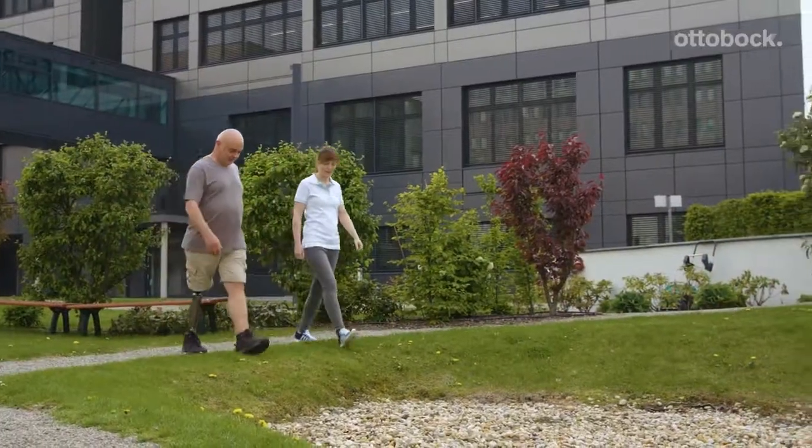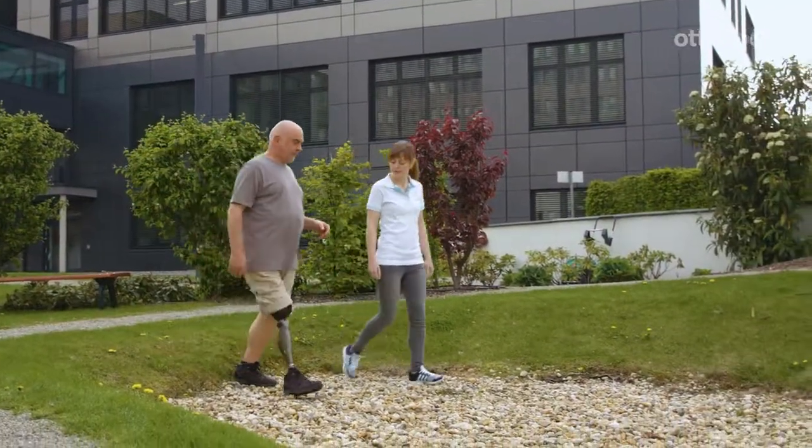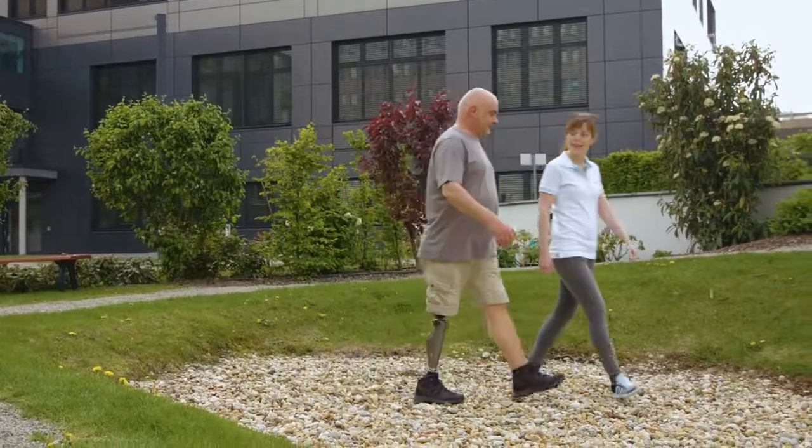Walking over different types of terrain in combination with slopes is an important part of the training.